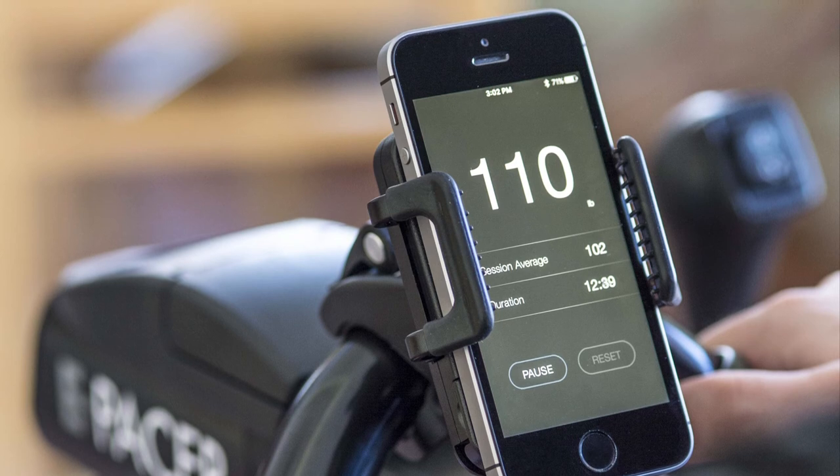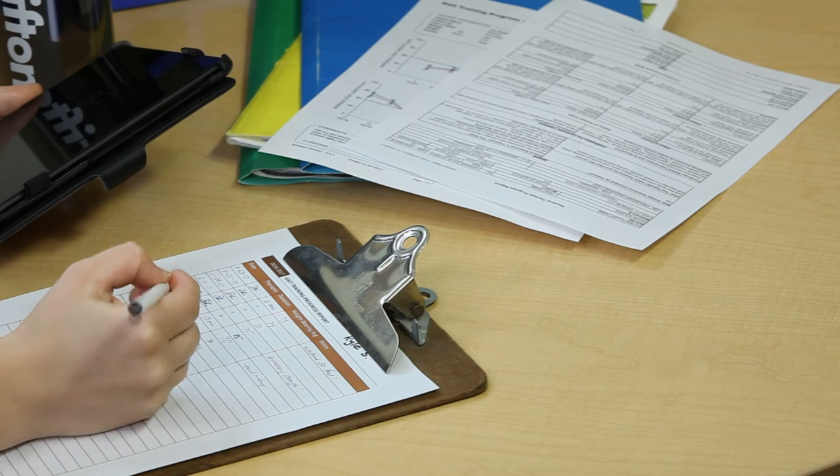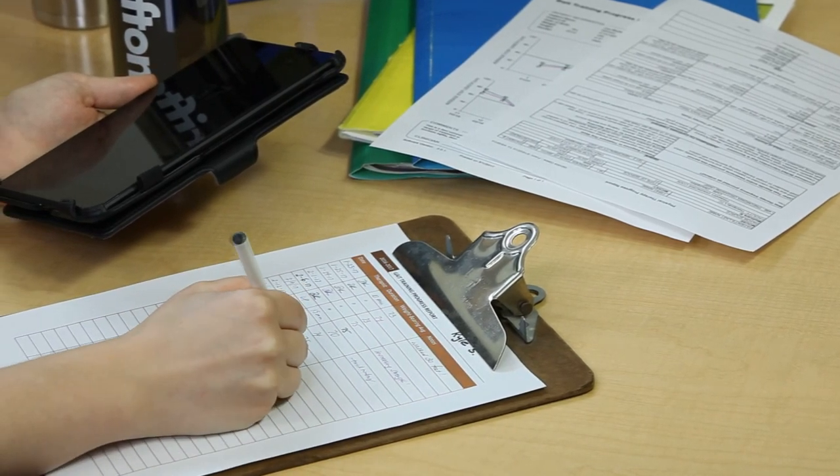When the session is over, press the pause button. The app will display the average weight bearing measured during the session, which provides a useful metric for tracking progress over multiple sessions.